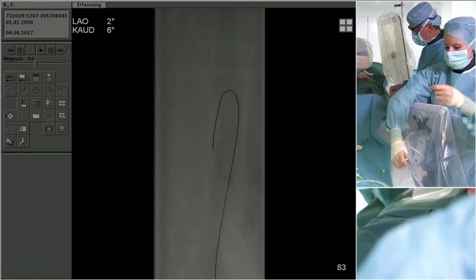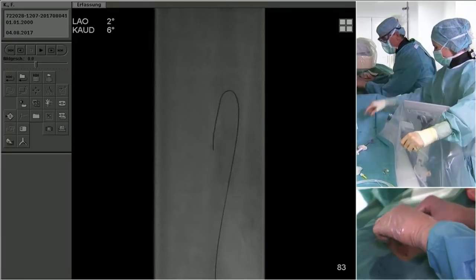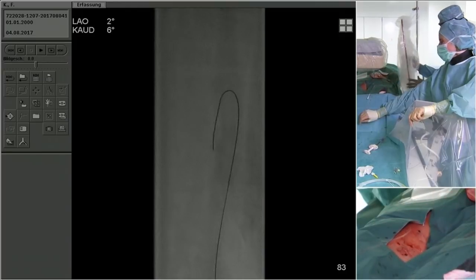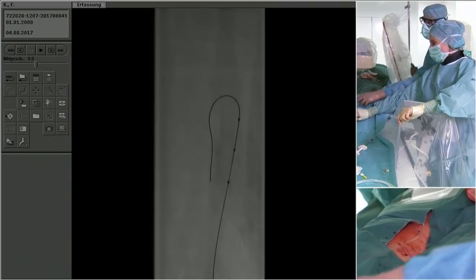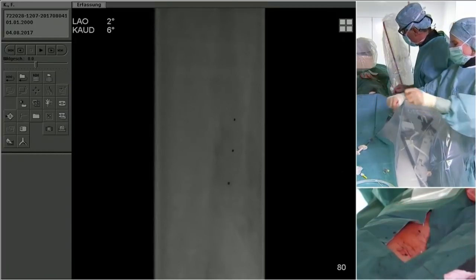I think the artery where I punctured, that small channel easily dissected. And therefore the wire, I'm still not sure whether I was in the vein or in a dissection, but probably in the vein. And then it was hard to really feel where the wire actually has its proper way up.